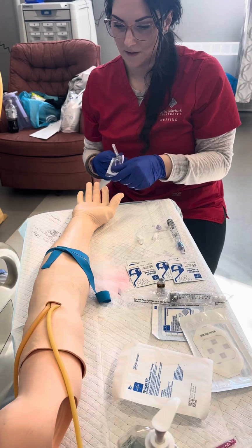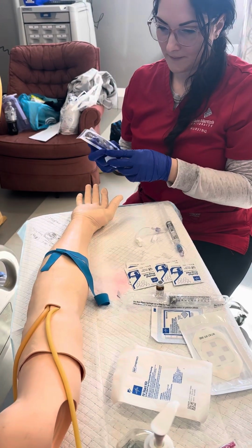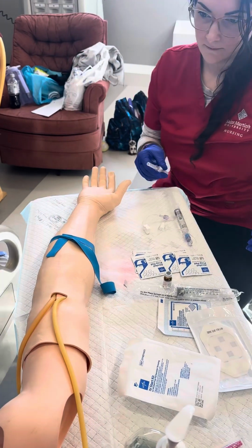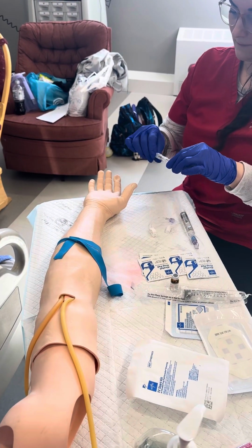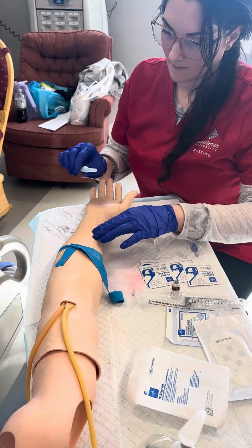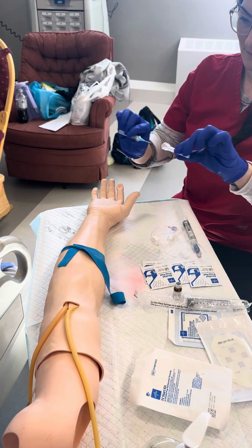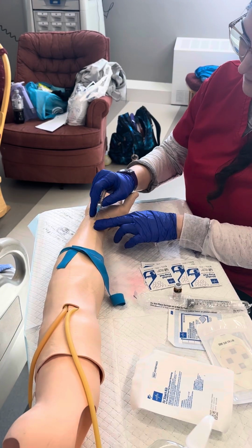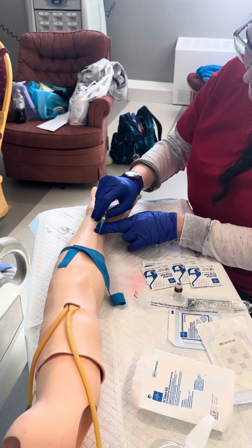Okay, assess your radial pulse again. Pull down.